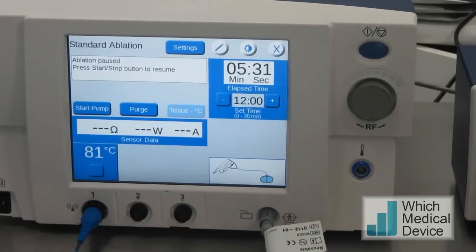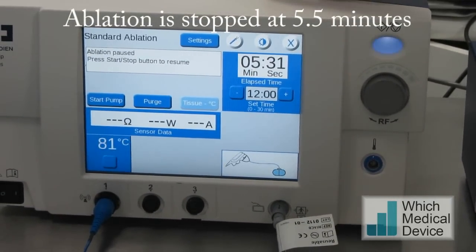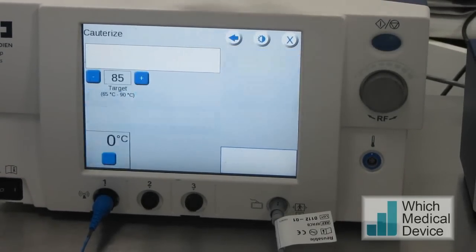The pump's turned off now. The ablation's finished at five and a half minutes. You can see the temperature reached at least 81 degrees, which is a good ablation. We're now going to do track ablation to make sure we don't get any seeding along the track.